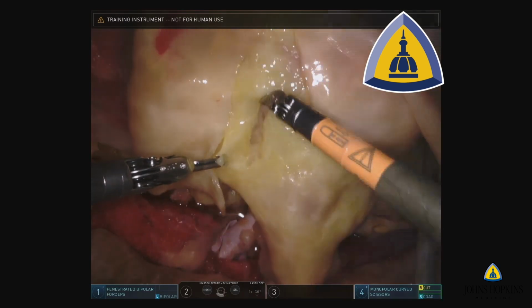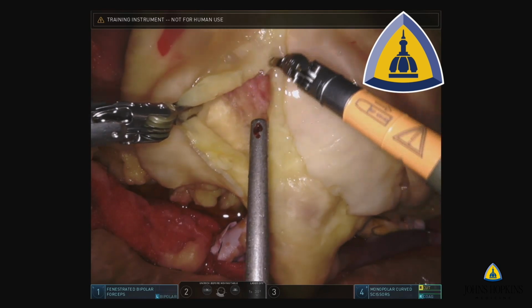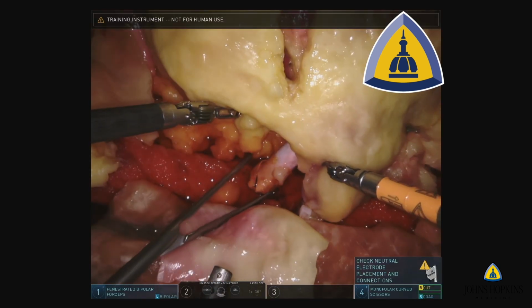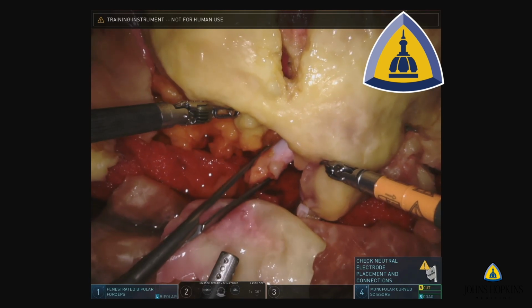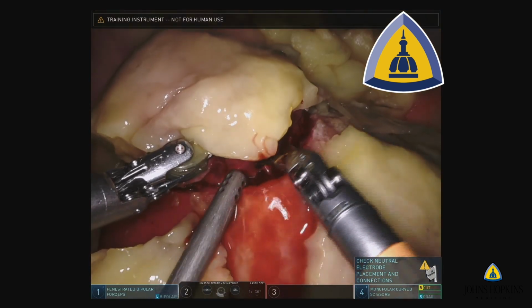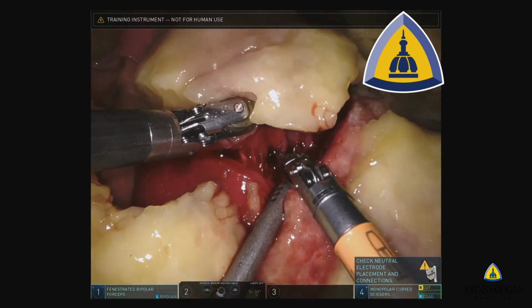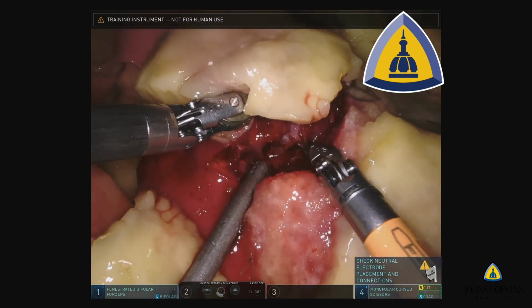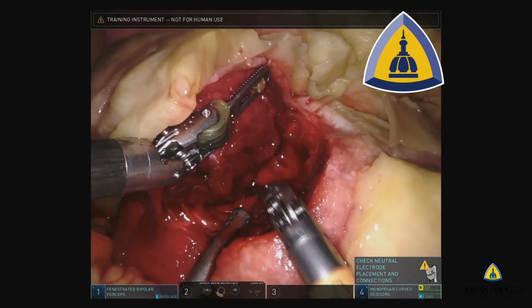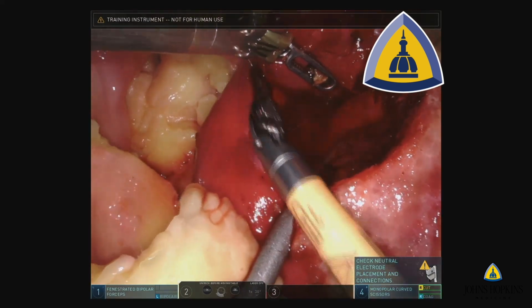They then open the Gerota's fascia, and you can see there's a distinct texture of fat, which is very similar to the Gerota's fascia in a patient. They undergo clamping of the renal artery, and then they start resection. In the first few cuts, there's not a lot of bleeding as usual, but then the deeper you get towards the tumor, there's a significant amount of what we like to call venous ooze because the vein was not clamped on this practice. The suction here, the assistant, is essential to keep a good plane of view.